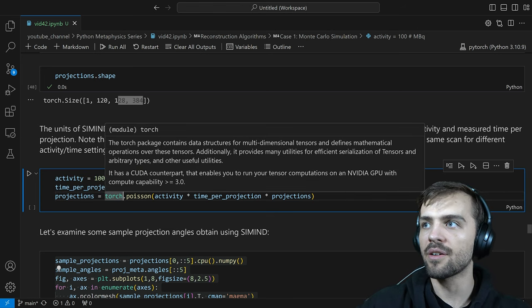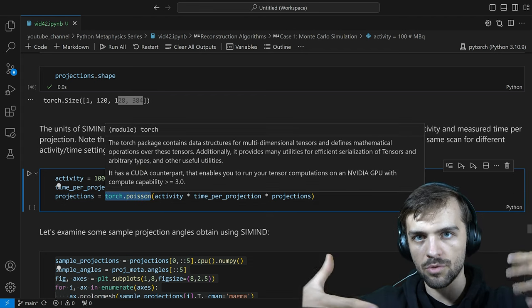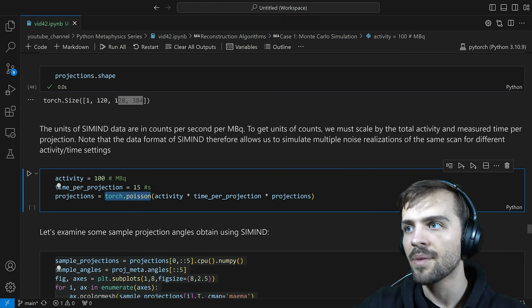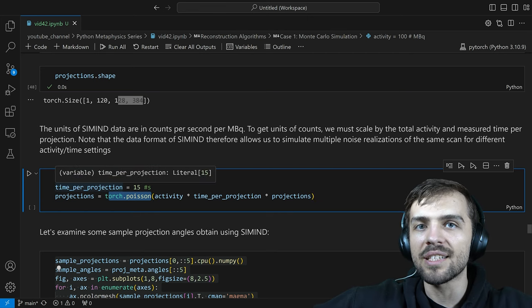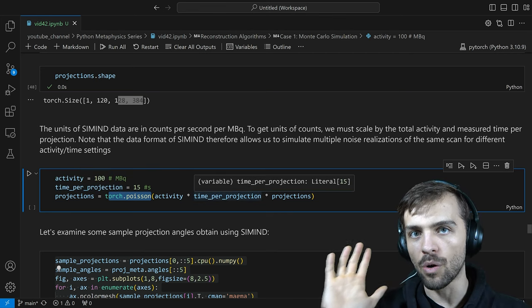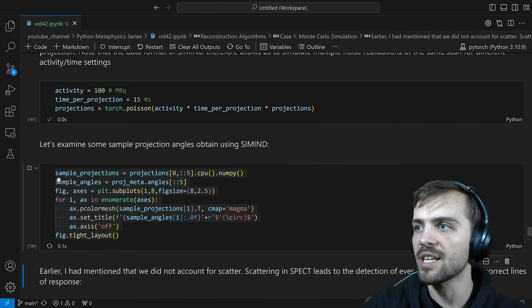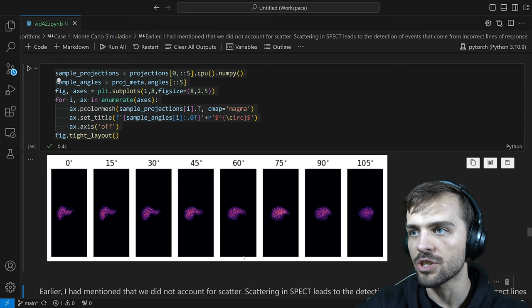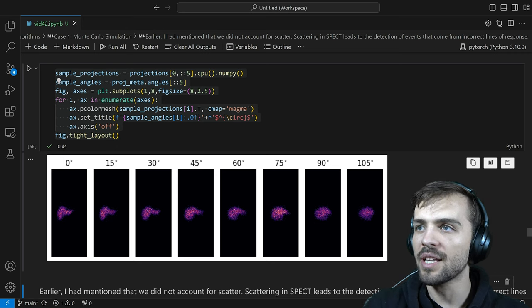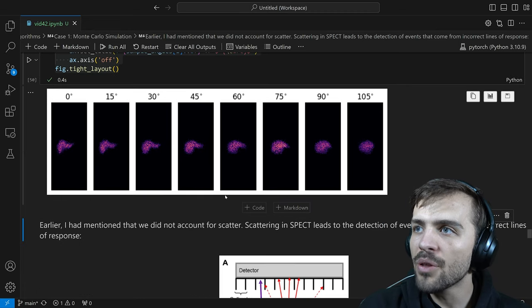Now I get one particular noise realization for the projections and can look at projections at all different angles. You can see it looks like a liver — this is at 0 degrees — imaging the liver at all different detector angles. One thing I should mention: another thing you have to take into account in SPECT imaging is scattering, which leads to detection events from incorrect lines of response.